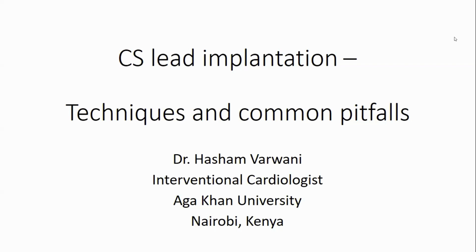As Dr. Jailan said, my background is in interventional cardiology, and a lot of the techniques that we employ in CRT implantation come with a bit of bias from that side. But then it's good we have other colleagues who will guide us on what else they do, and we'll have an open discussion on that. So I'll very quickly go through the steps of implanting the CS lead or the LV lead, and take us through some common pitfalls that occur during the procedure.